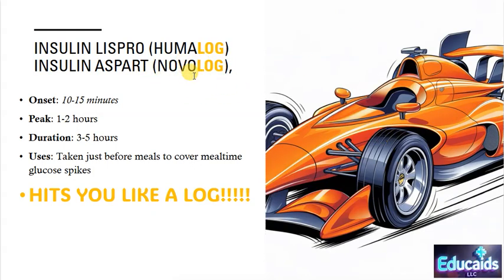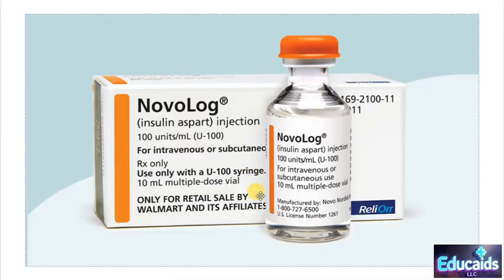Oftentimes with Novolog pen, there will be orange on it, so I want you to associate that with a race car, that it works quickly. If you can see here, the onset is in 10 to 15 minutes. And so students, as the nurse, I want you to counsel your patients. This is not the type of insulin you take and then drive to the restaurant, because your patient might go hypoglycemic before they arrive.